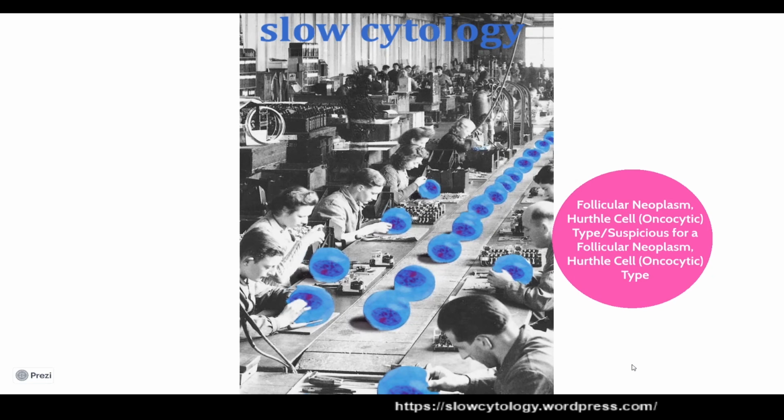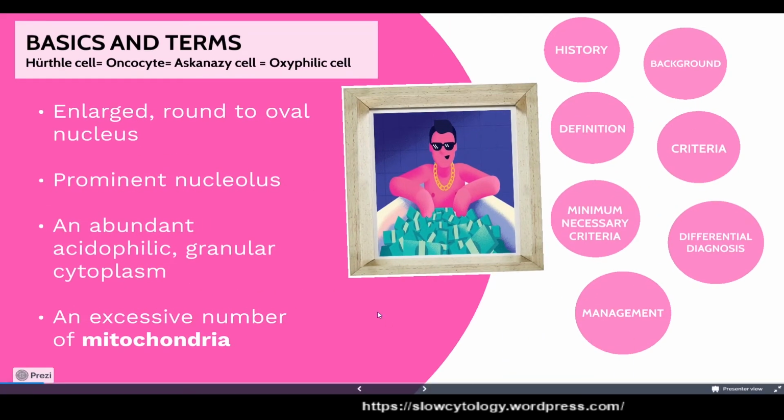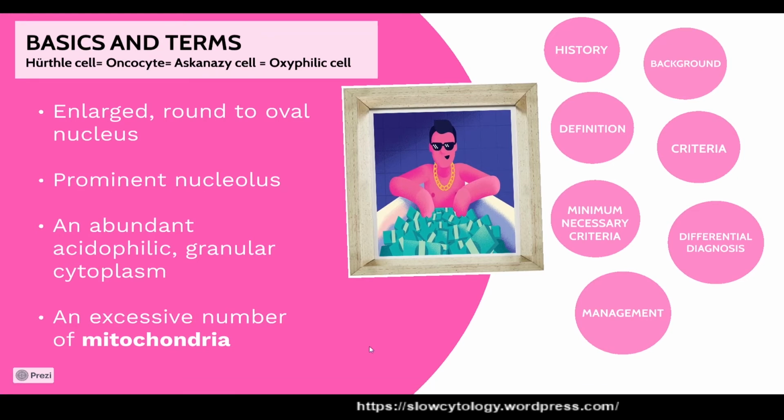Hi all, I would like to share a presentation with you about suspicious for a follicular neoplasm, Hurthle cell type. Firstly, I would like to talk about basics, terms, and history.